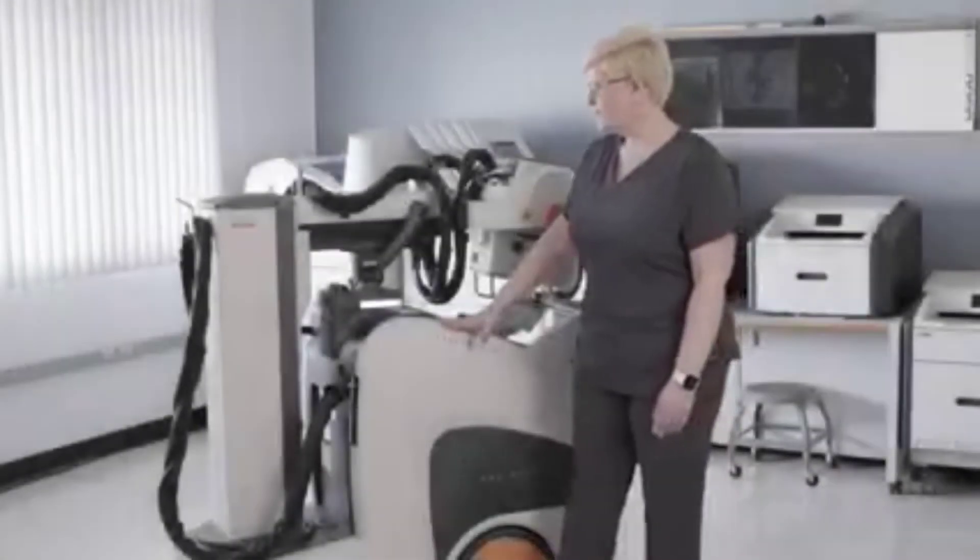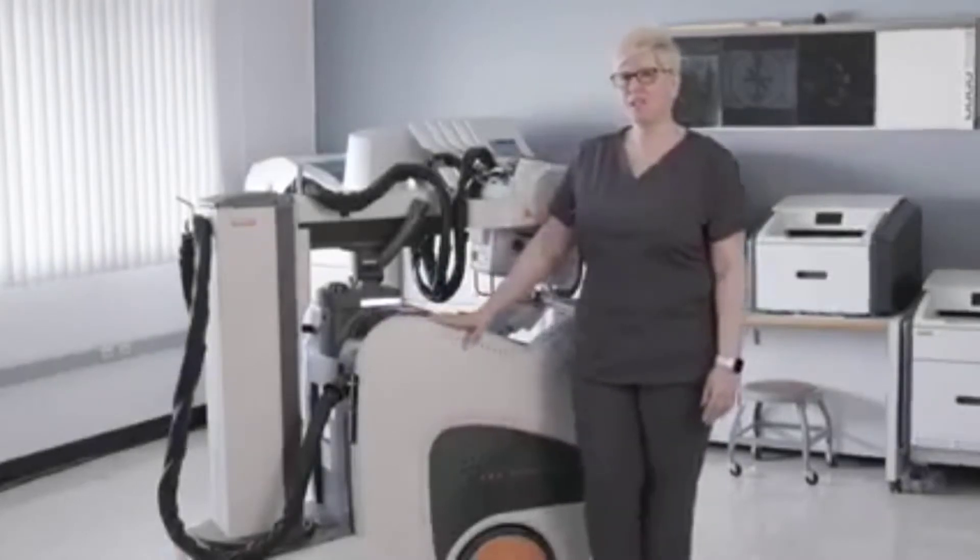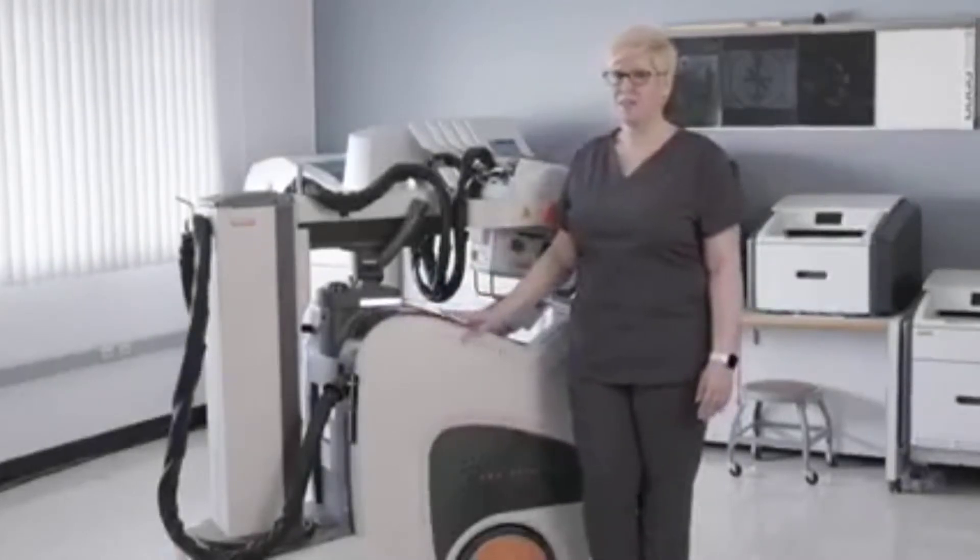Hi, my name is Jen Twaits. I'm the applications engineer here at CareStream and today I want to talk to you a little bit about the DRX Revolution Mobile X-Ray System.